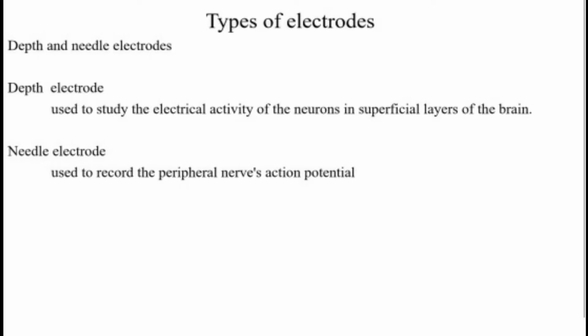Normally, each depth electrode consists of a bundle of Teflon insulated platinum iridium alloy wires in the ratio of 90 and 10, bonded to a central supporting stainless steel wire, which can act as an electrode by an insulating varnish. The end of the supporting wire is rounded for ease of insertion into the brain.